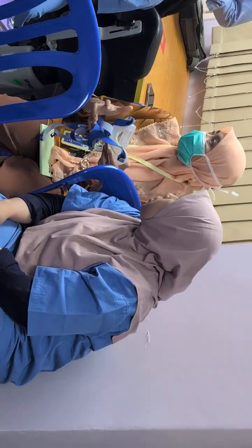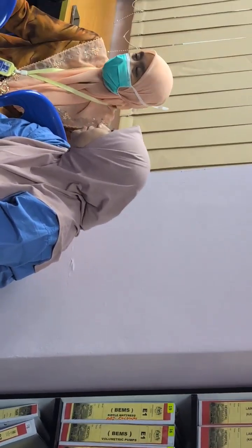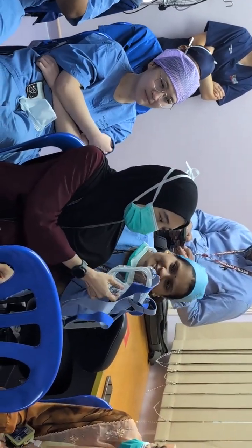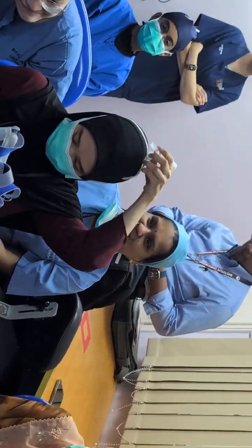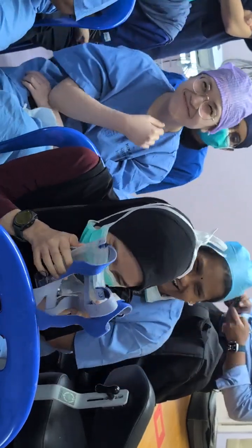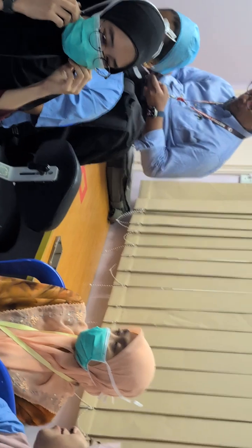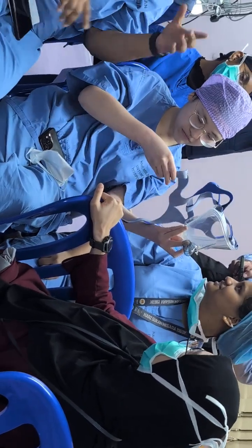Who is the smallest person here? No lah. What actually? No, don't take out the mask. Don't take out the mask. Above the eyes. It fits. But this can be different. Oh. Doesn't fit. Tina did it, maybe. Tina did it. Tina's face also something like you're wrong.